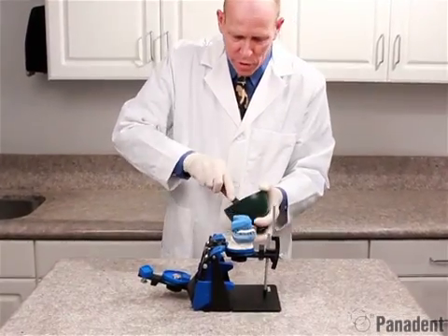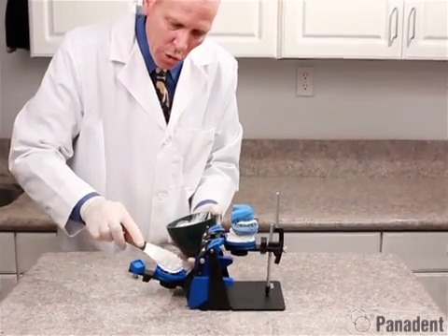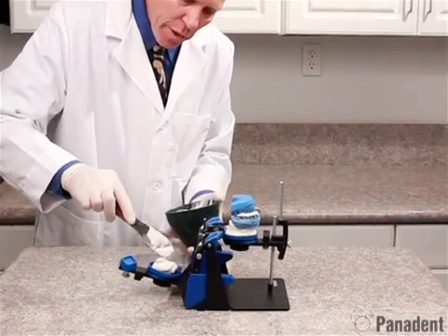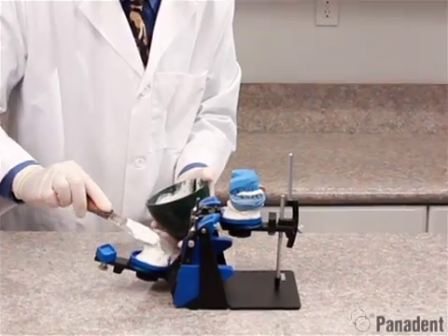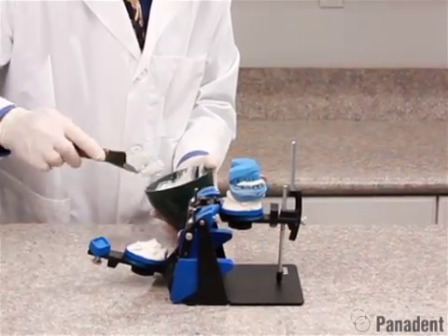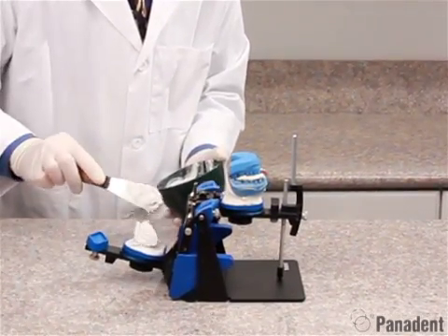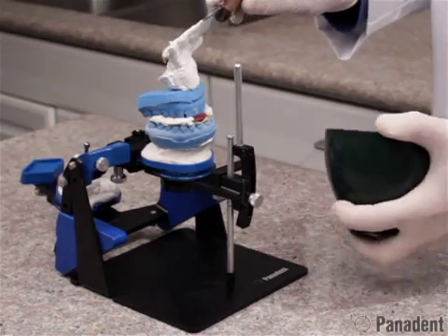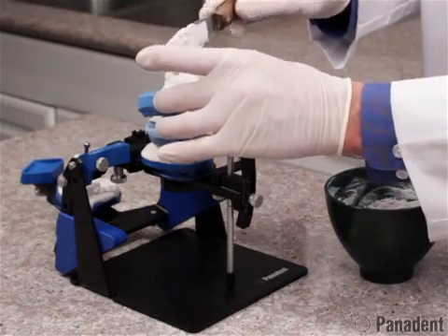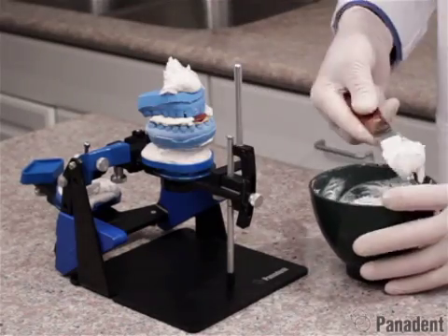We've mixed the plaster and we first want to add some plaster to our lower mounting plate. Make sure we get it around the center retention lug really well. And we want to go ahead and fill that mounting plate up because we have retention lugs around the lateral edges. And so we'll add some plaster to that and then we'll add a little plaster to our model.